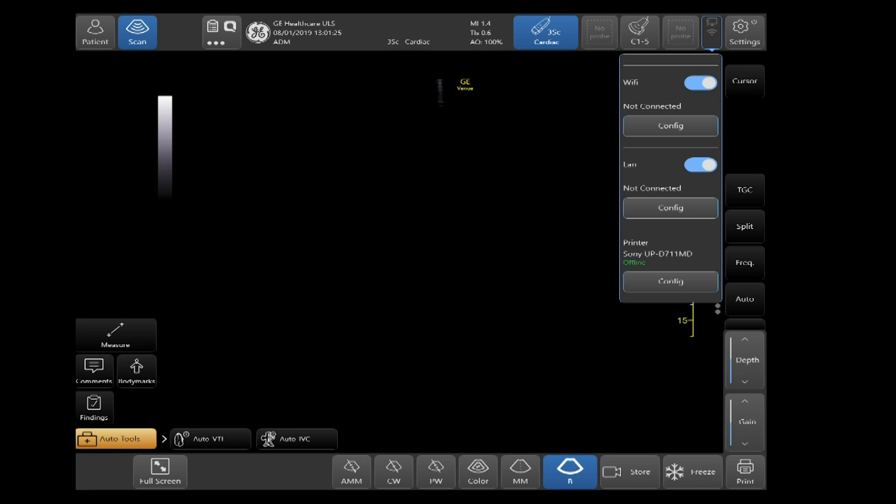Once you select it, you'll see a list of options. You're going to select Config under Wi-Fi.